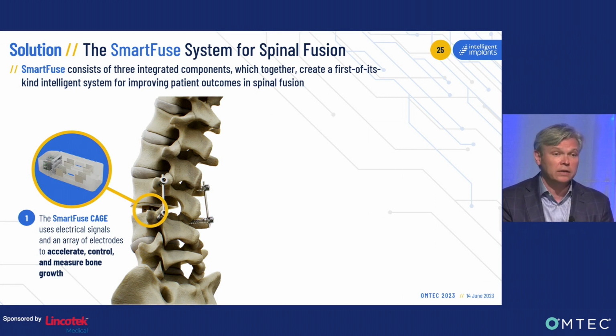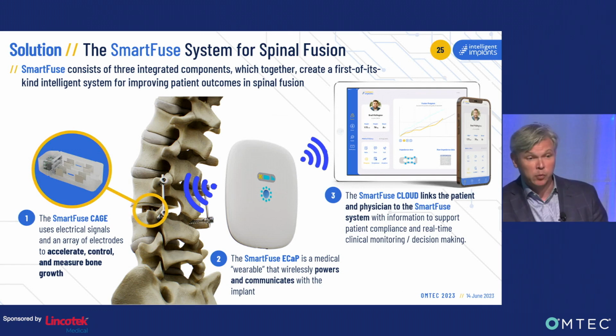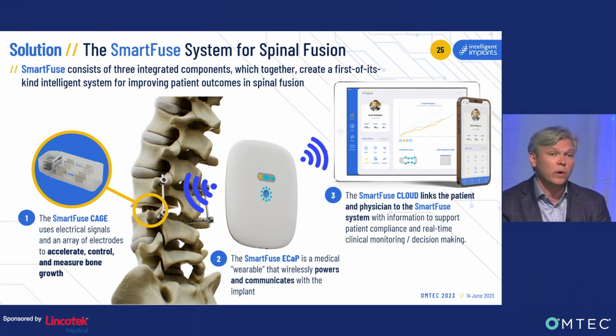Our system has three components. There's the implant itself, and like Debbie, we don't want to put a battery in our implant, so we power it wirelessly. There's an external medical wearable that the patient wears when they're getting therapy or when you need to collect data.